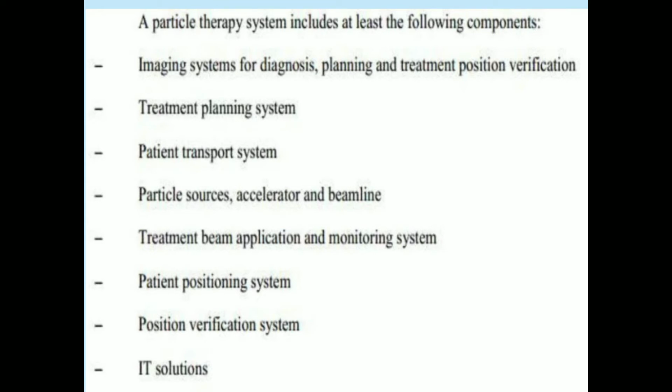A particle therapy system includes at least the following components: imaging systems for diagnosis, planning, and treatment position verification, treatment planning system, patient transport system, particle sources, accelerator and beamline, treatment beam application and monitoring system, patient position system, position verification system, and IT solutions.